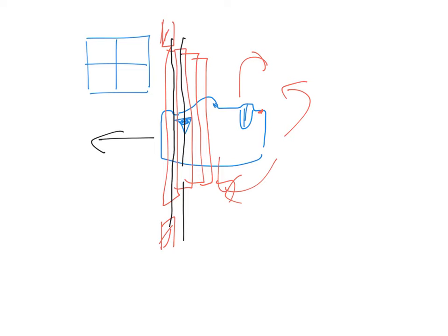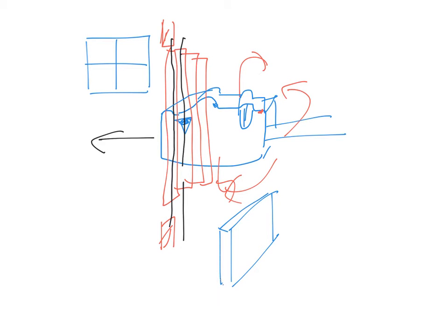So what this assumes is, if I were to look at a 3D image of this person's face, a 3D image will be quite hard to draw, but let's assume that this is a 3D image. Does this look like a 3D image? Okay, so I'm going to show you how to get the image of one slice. So one slice is something like this. Alright, so you get the image of one slice from the human body. Alright, and I'll show you the next slide.